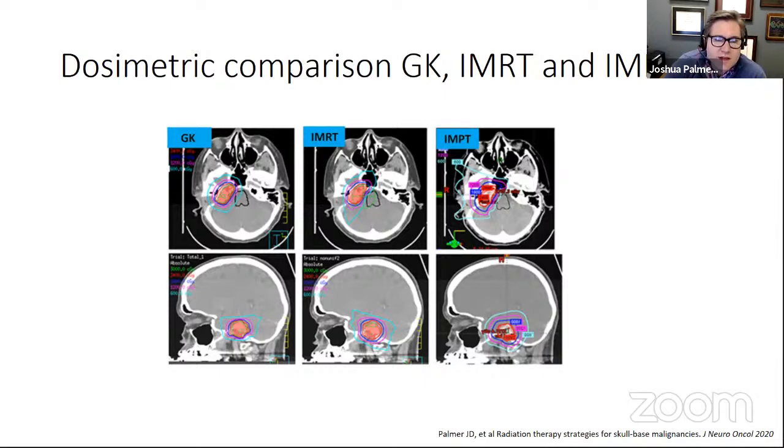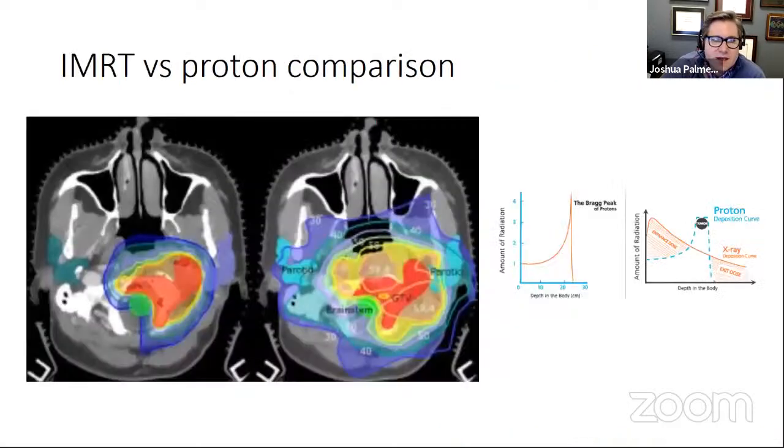particle or proton therapy. And nowadays, and Dr. Trifoletti can go through this in great detail too, we have carbon available in some of the European and Asian countries and should soon have carbon available in the United States. Just to hammer home the differences in how we choose these, this is a tumor in the skull base and upper cervical spine, demonstrating how we go about, from a radiation perspective, treating a tumor that involves a number of skull base structures and head and neck structures.